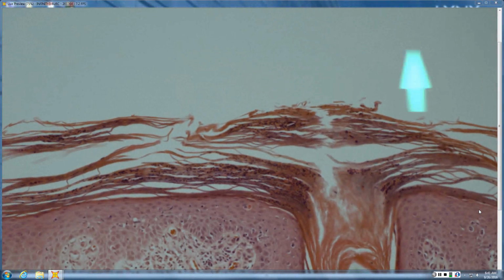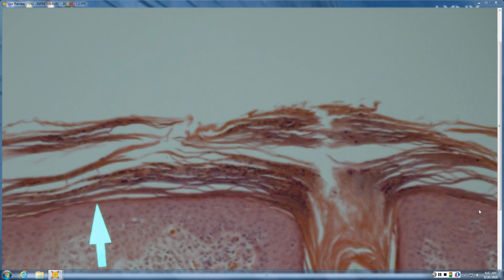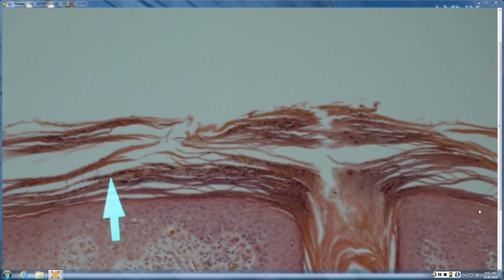You like it like in the book, where it's this huge, thick plaque, and you've got parakeratosis that goes left to right, that is confluent. And then within, you get layering of neutrophils. So we call this the sandwich sign, or I like to call it more the lasagna sign. But basically, when you see that layering, that confluent parakeratosis with layering of neutrophils, that really suggests psoriasis.